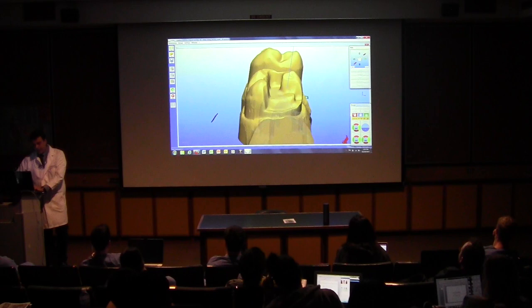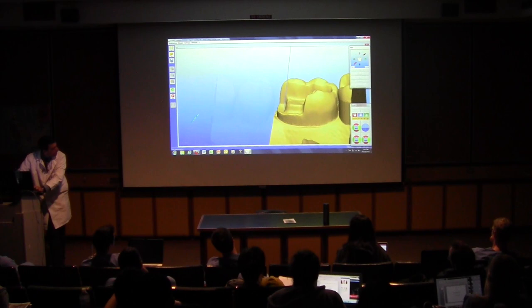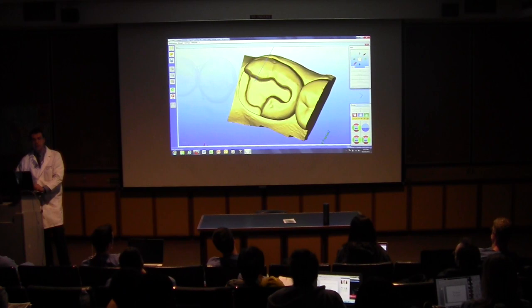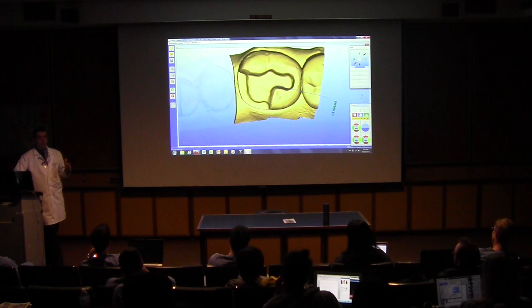Do you see the axial wall here? Do you see some convergency on the axial wall? Right there? Look over here. Rounded. Okay? Now, do we have enough reduction? It's all right. This is pretty decent. So that's the thing I want you guys to play with for project number 11. You're going to use it on your computer. You're going to play with this file here.